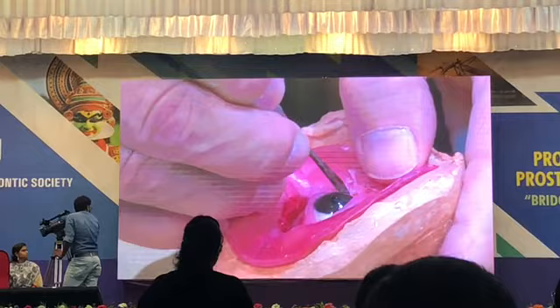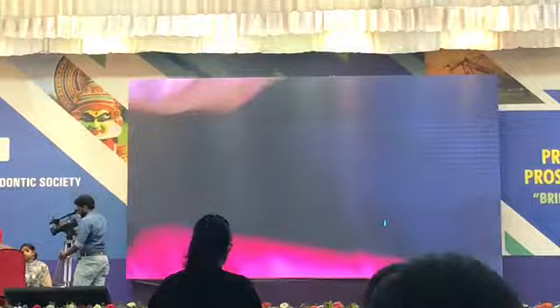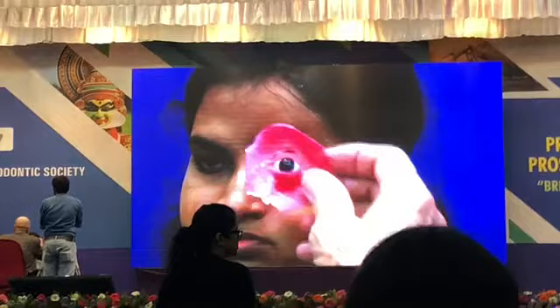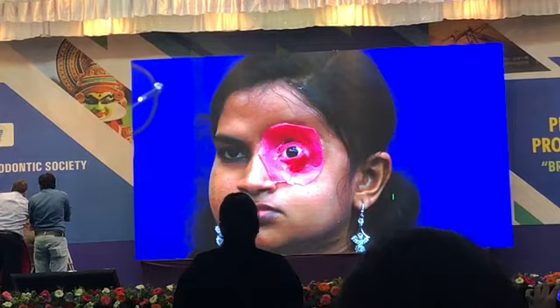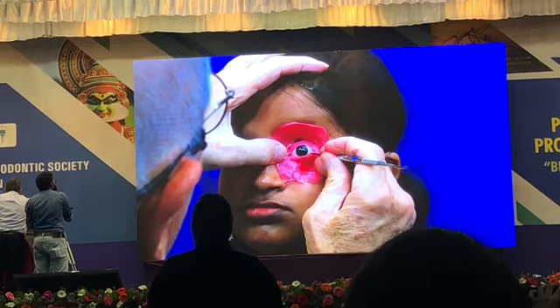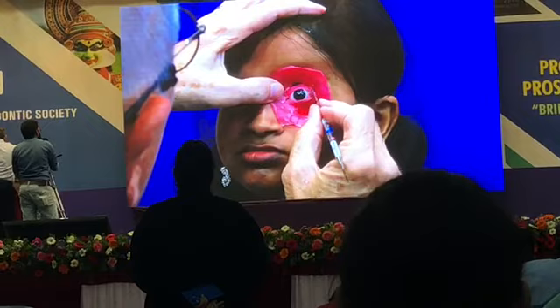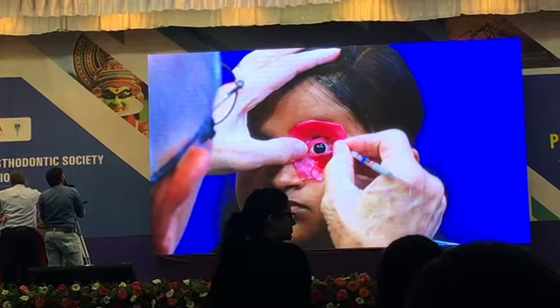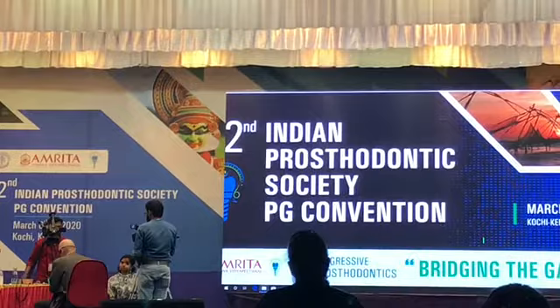Try it on, see what we got. Okay. Let's see. The globe is not too bad. I don't have the lids right, but yeah, it looks pretty good. So I think we have the globe in pretty good position. So now you begin to sculpt. So you need to put some wax in there.